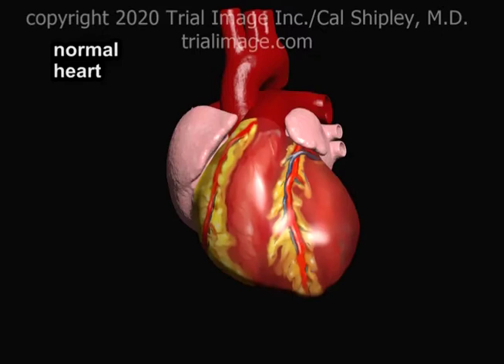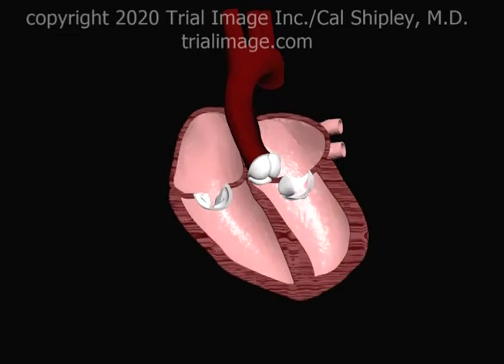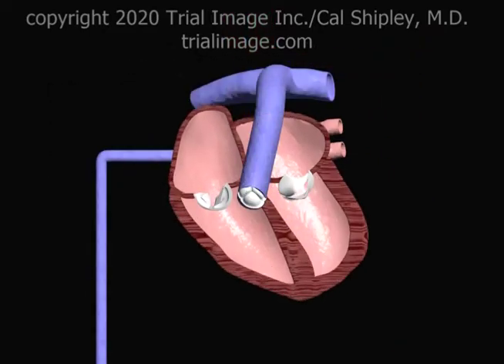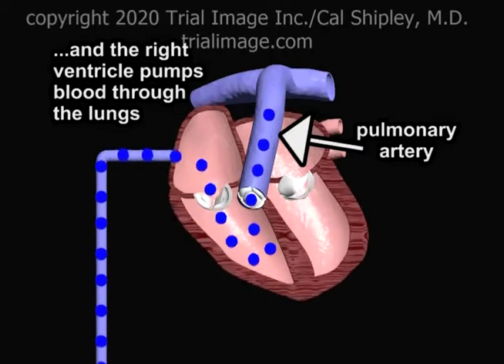In a normal heart, the primary blood pumping chambers are the left and right ventricles. The left ventricle pumps oxygenated blood through the aorta to all bodily organs and tissues. Oxygen-poor blood returns to the heart via the venous system and is pumped through the lungs by the right ventricle.